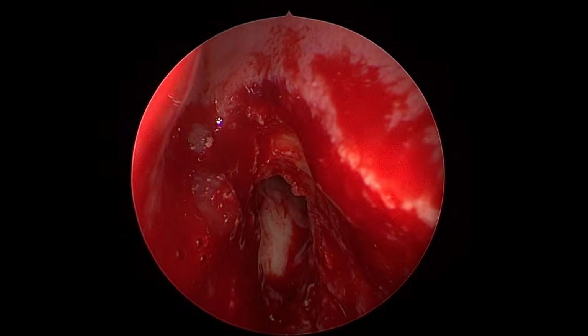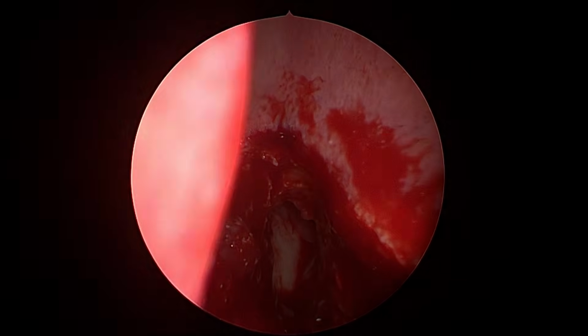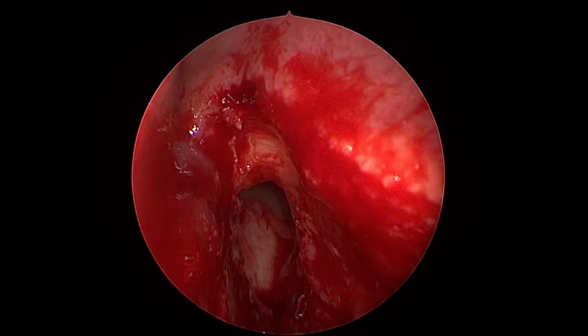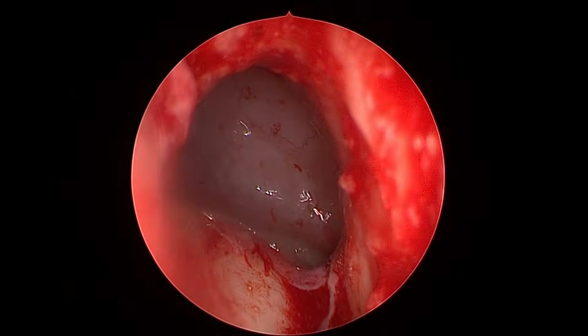Boss, which drill have you used? Which drill bit? The favorite stylus from Medtronic. Tapering. Angulation is it? This is a transnasal 15-degree naturally curved. See now the frontal from inside.